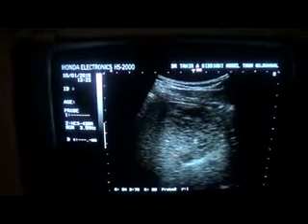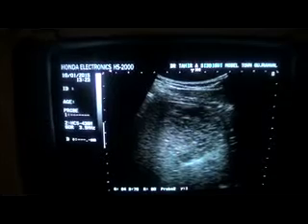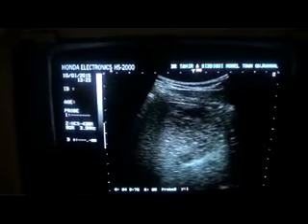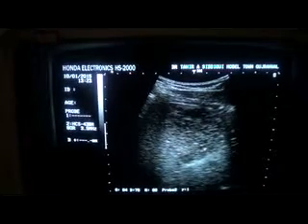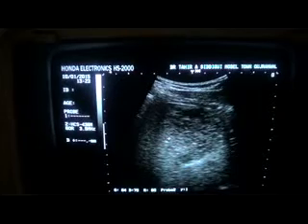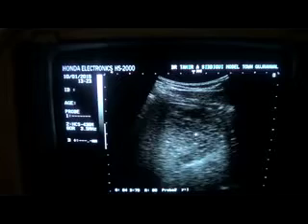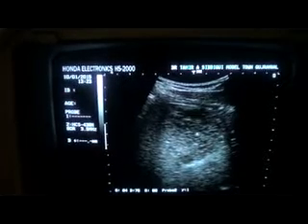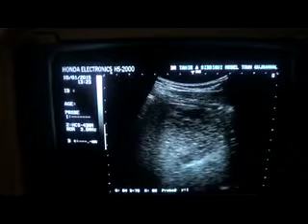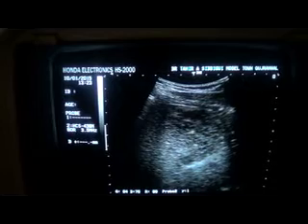Now, if the surgeon has to, or you have to do an interventional procedure to remove the internal pus or the material which it contains, then you will need a wide bore needle. If you report like this, it becomes easy for the surgeon to decide which bore needle to use, so that you can easily remove this material.